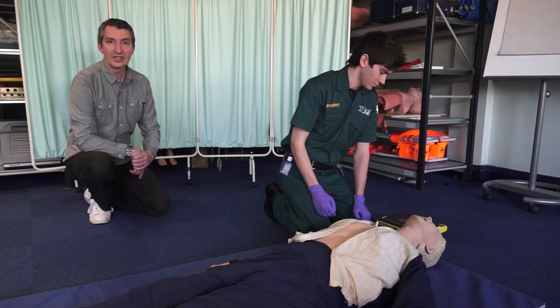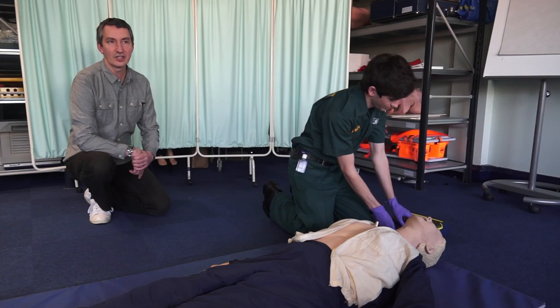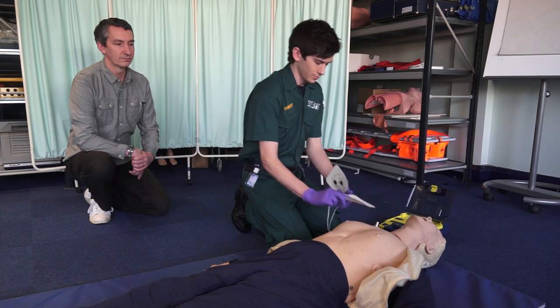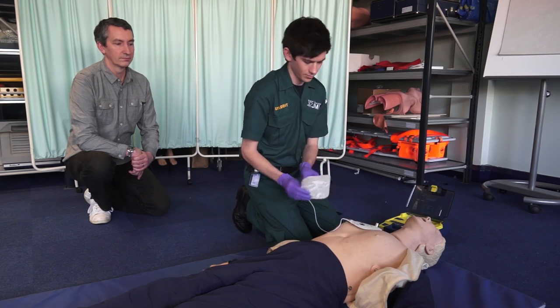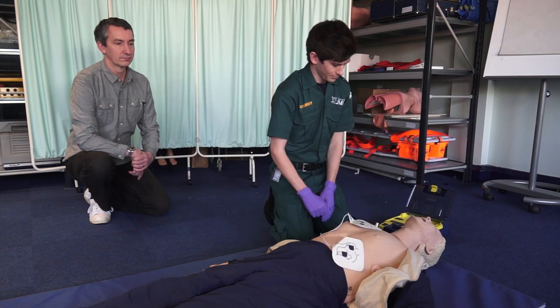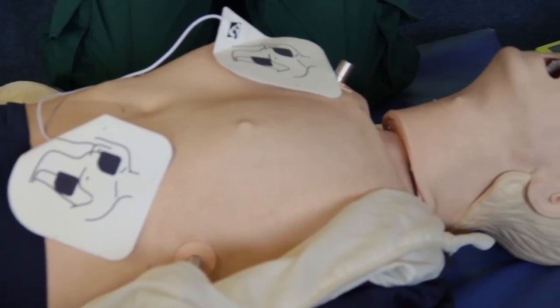And if the patient isn't breathing, we need to apply the AED, the automated external defibrillator. Tear open package and remove pads. Peel one pad from plastic liner. Place one pad on bare upper chest. Peel second pad and place on bare lower chest as shown. Do not touch patient. Analyzing rhythm. Shock advised. Charging. Stand clear. Push flashing button to deliver shock. Stand clear.